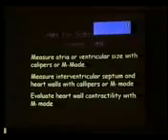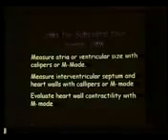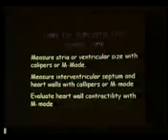We use this for measuring the size of the ventricles, because the subcostal view gives a beautiful image and the measurements are easy. Evaluating the heart wall contractility with M-mode is another indication for the subcostal view. So here is the subcostal view.